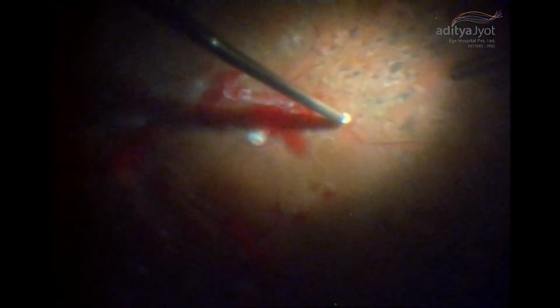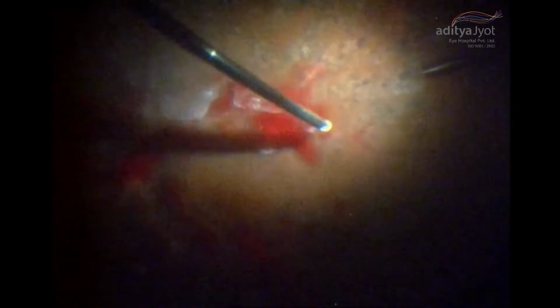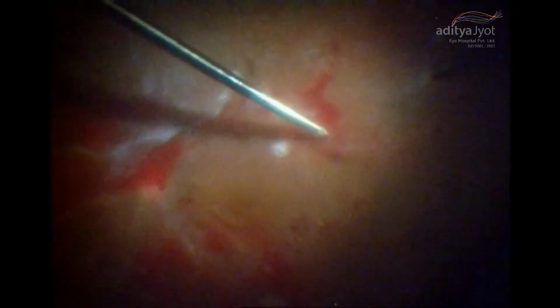So now I'm releasing all the tangential traction, again using the proportional mode, and making a cleavage between the membrane and the underlying retina, and then using the cutter to do delamination and segmentation, and finally make sure all membranes are removed. By this way you can also use steroid to stain, which will help. And the only thing is that in a microscope you will be seeing through the binocular, and here you are seeing using the 3D glass on the big screen, so all the people in the OT, the fellows, can learn.